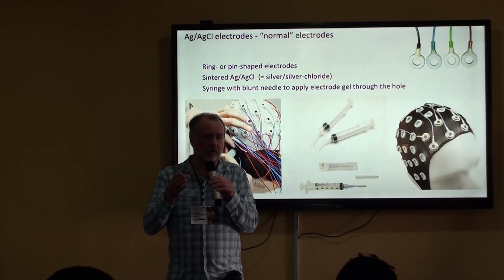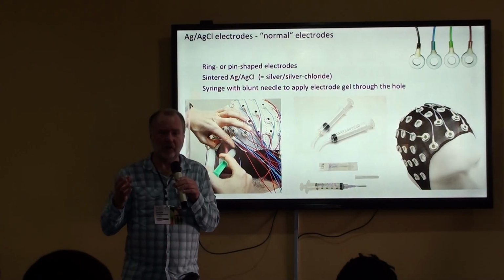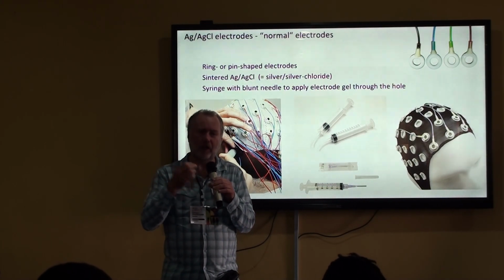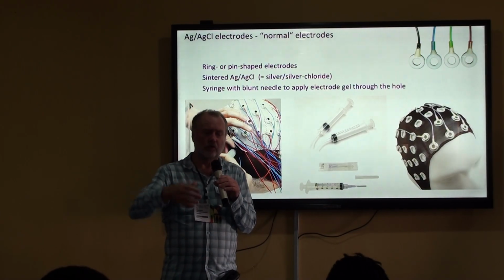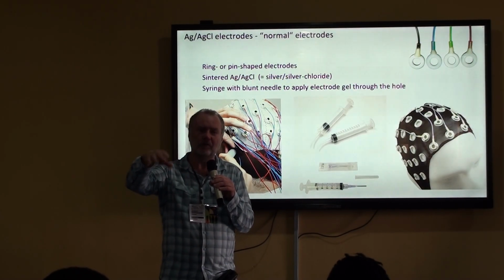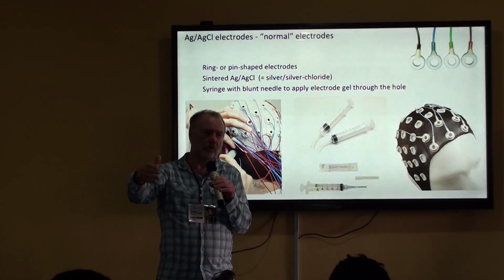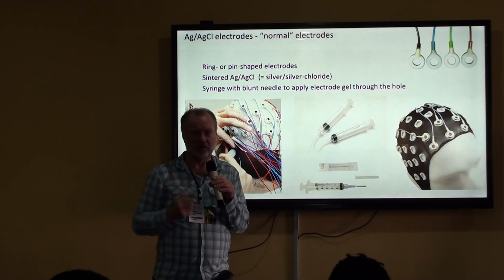I clearly see the usefulness and the need for that, especially for clinical applications, where, for example, you would want to have an EEG system somewhere in a small village without the expertise, where you would want a neurologist to look along with the EEG at a distance.